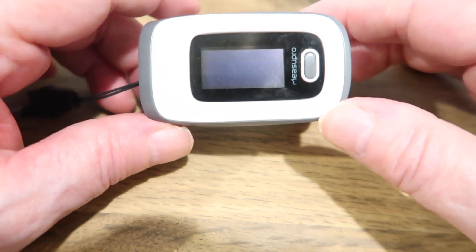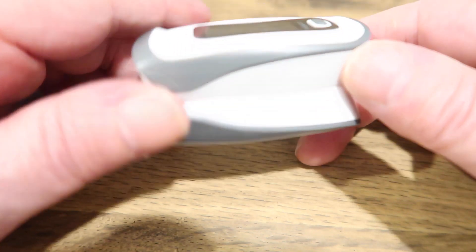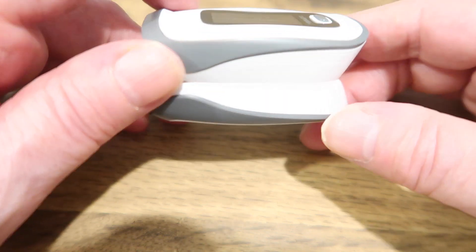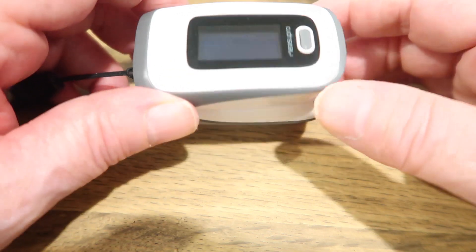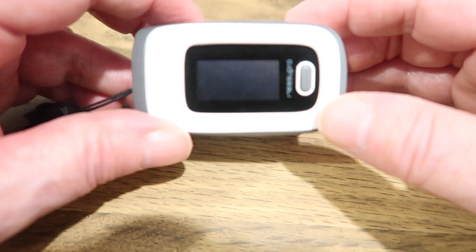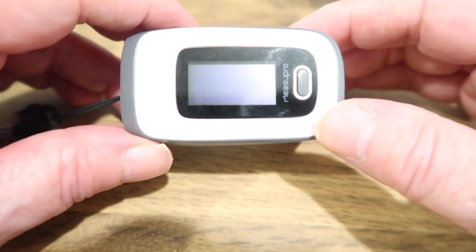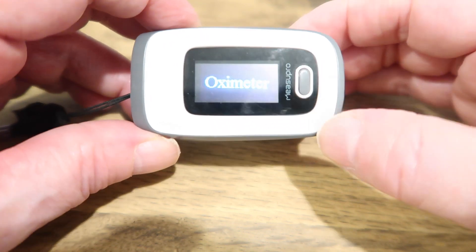This is an oximeter and it measures the oxygen level in your blood. You can buy these relatively cheaply on Amazon and you've probably seen these before — GPs have them, hospitals have them. You can buy these yourself, and it would be handy to have one of these in case you do get the COVID-19 virus.